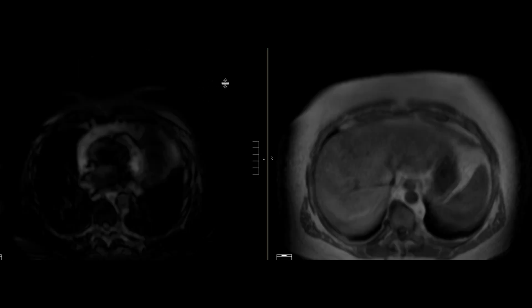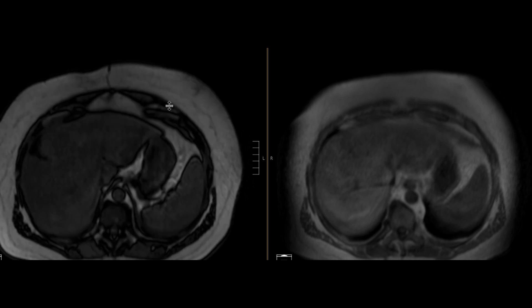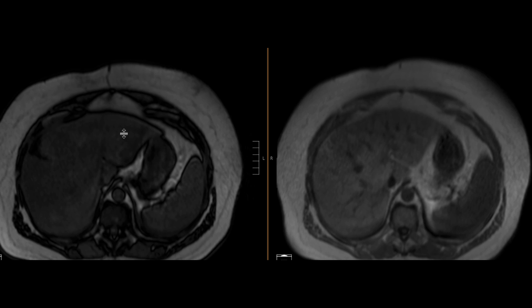So here we have the MRI images. I'm going to go straight to the T1 in and out-of-phase sequence. We can see the out-of-phase sequence with the India ink artifact at the interface of fat and water. This is the in-phase sequence on this patient, and we can see that on the in-phase sequence the liver is brighter than the spleen, as we would expect, but in the out-of-phase sequence it is the same to darker signal in certain areas compared to the spleen.